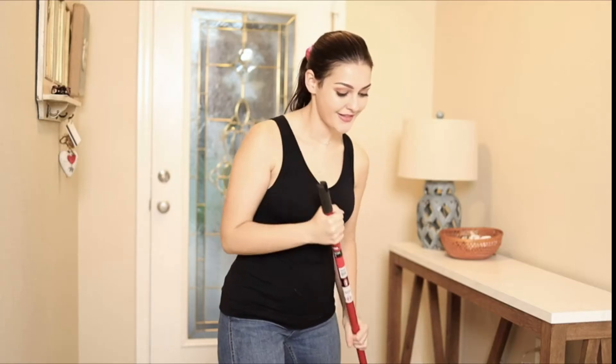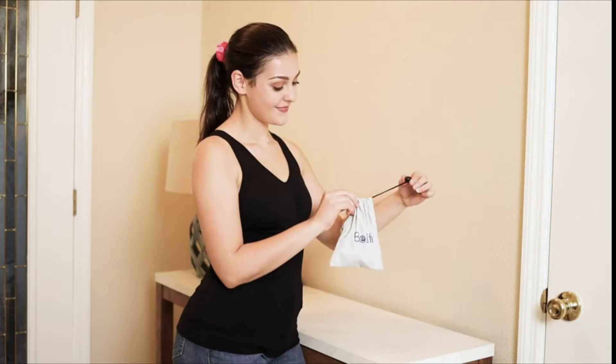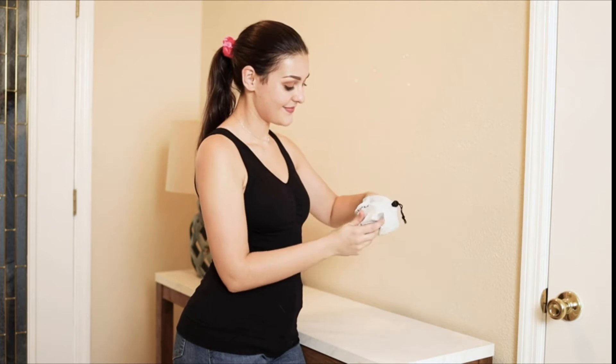By placing the pads exactly at the site of the pain, you get fast relief without having to digest potentially harmful or addictive prescription medicines.